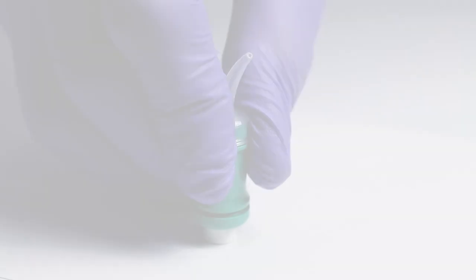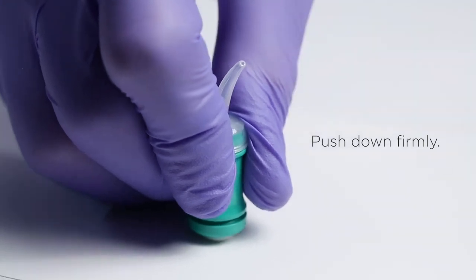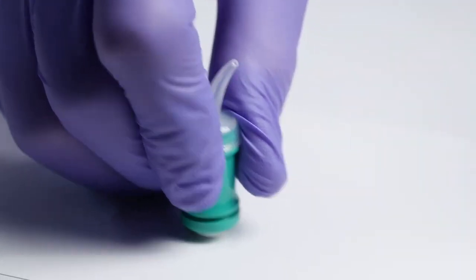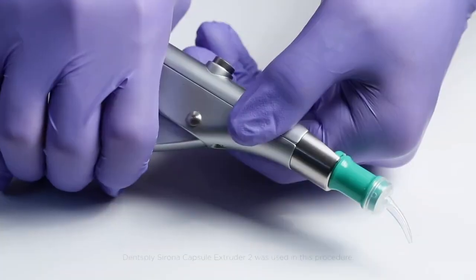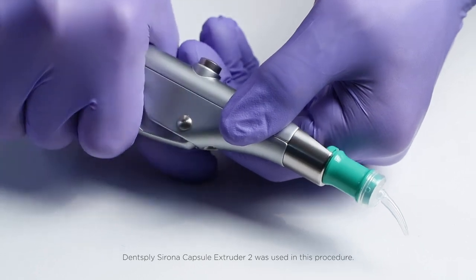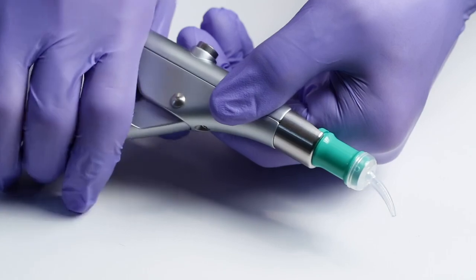After the crown and tooth have been prepared, activate the Calibra Bio Cement capsule by pushing firmly against a hard surface with the plunger facing down. Place in a high-frequency mixer for 8 seconds. Insert the capsule into an extruder using the grooves to hold it in place, and squeeze the lever until cement is seen through the clear nozzle.